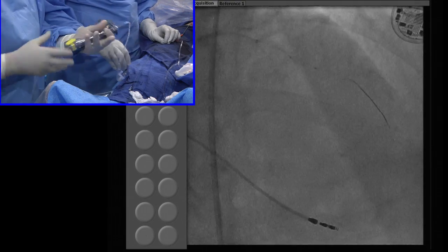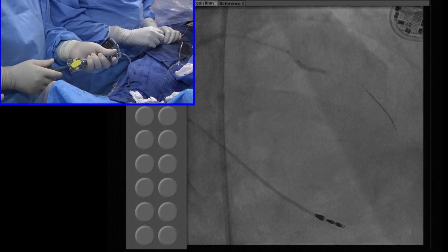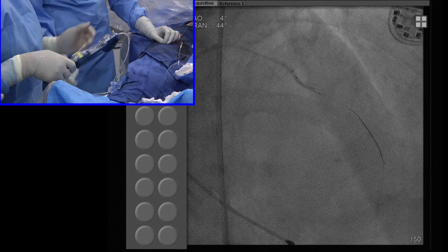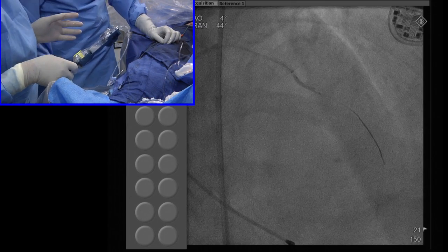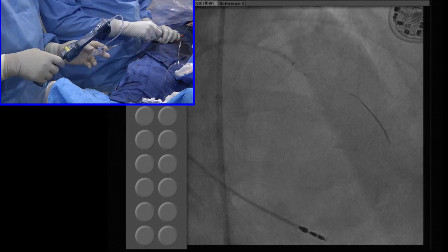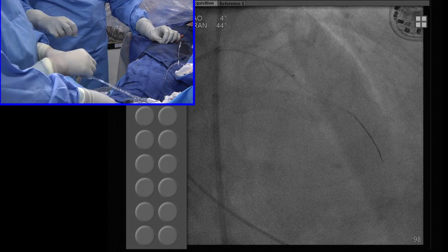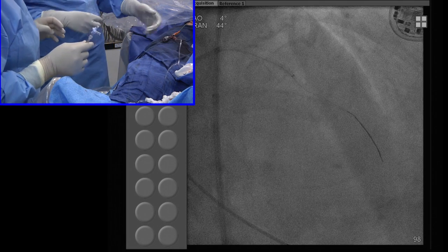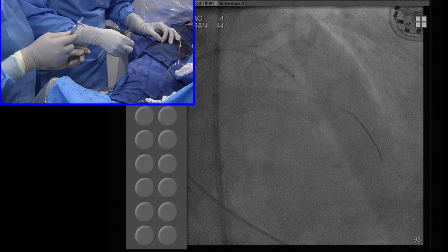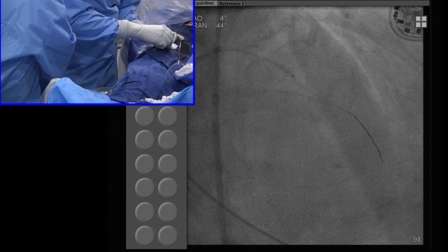Yep, there's just a couple of restrictions. So the 6 French guideliners, the 5 and 6, you can only use the 2.5 and 3.0 millimeter scaffold in that guideliner. And you need to insert the scaffold into the guideliner, past the notch where it goes into the guideliner lumen, outside the body before you introduce it, because it's a little snug. If you put the guideliner in first and then try to deliver absorb, then it'll get caught on the entry point to the guideliner. So the key is to preload the guideliner with the 2.5 or 3.0 absorb, and then introduce the whole system together. So what do you do if you have a 3.5? You can't use the 6 French guideliner. Then 7 French.